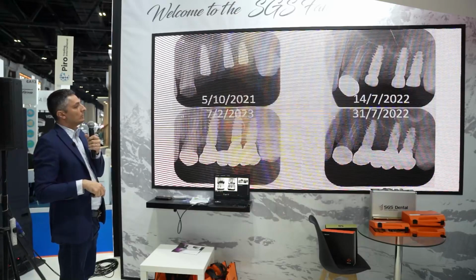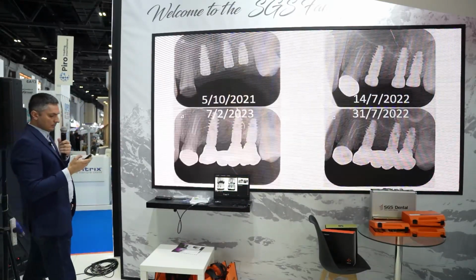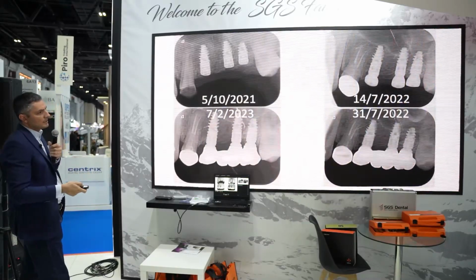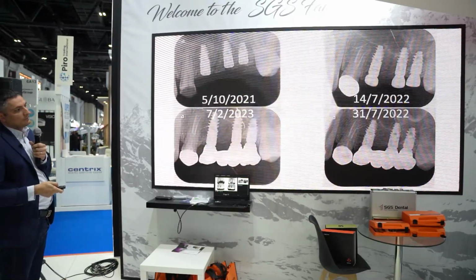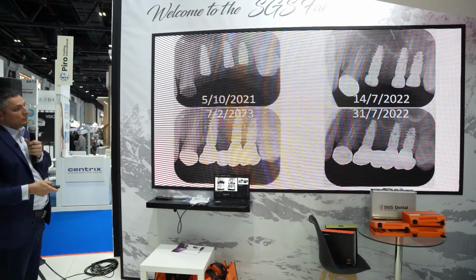Okay, the last 2 PAs, if you can see. This is the grafted implant. Here on the mesial there is slight bone loss, which is stable after so many months, as we can see here.